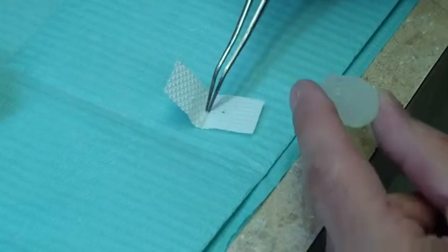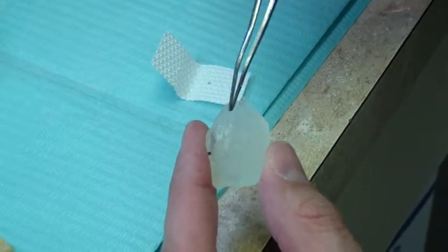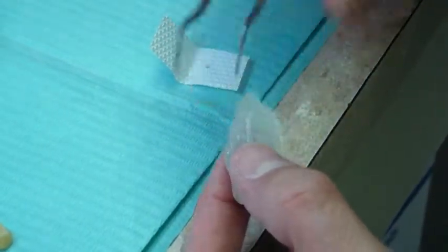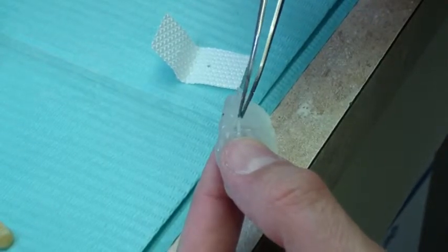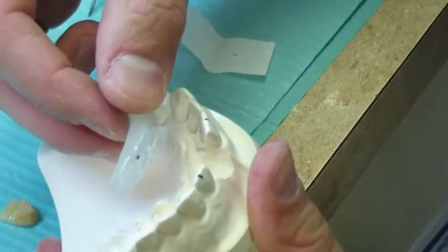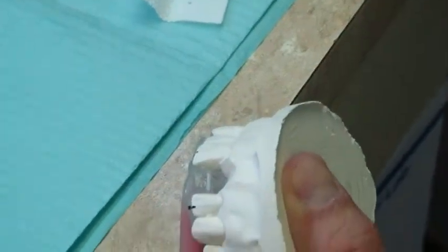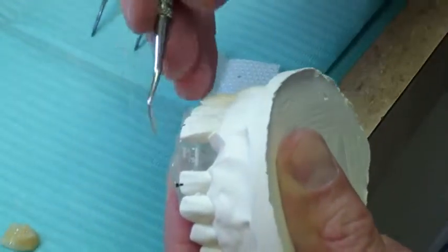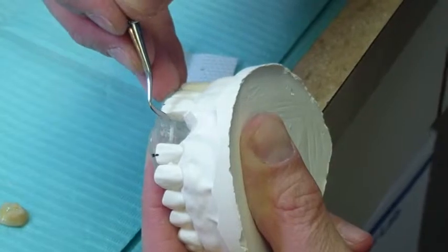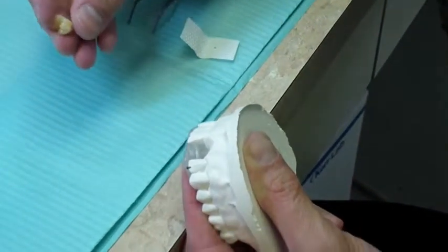Take the pre-cut length of Fast Splint Matrix 1-4 fiber and place it inside the trough or channel in the silicone index. Seat the index into the predefined position on the model, applying a firm pressure once the index is in its final position. Ensure that the fiber is in the correct position coming across the pontic space. Take the denture tooth and place it into position on the index, applying a firm pressure once seated.